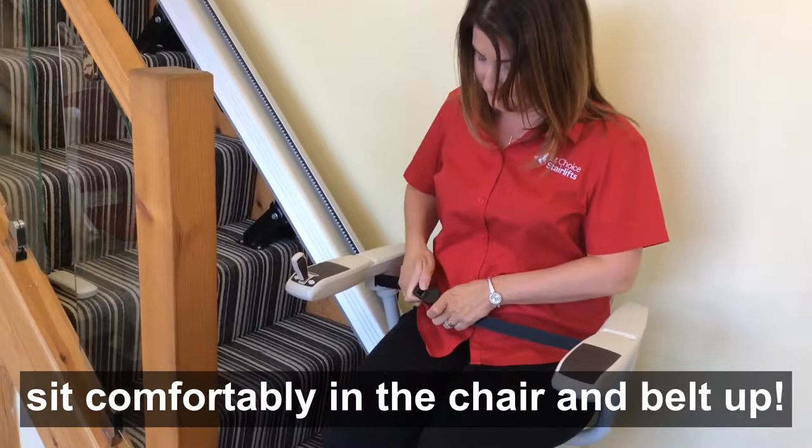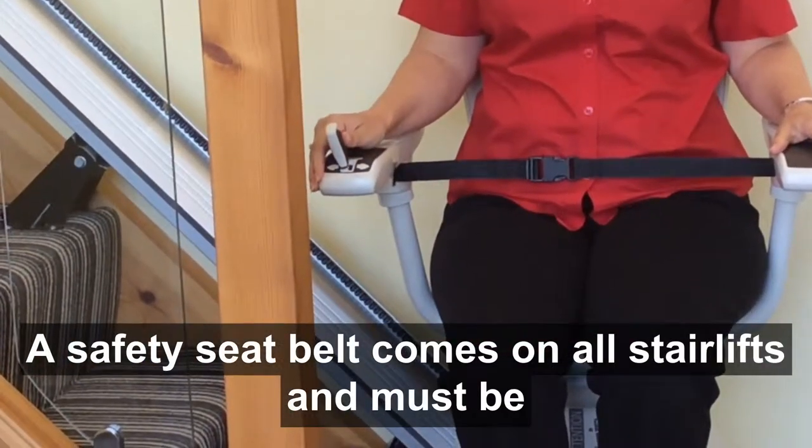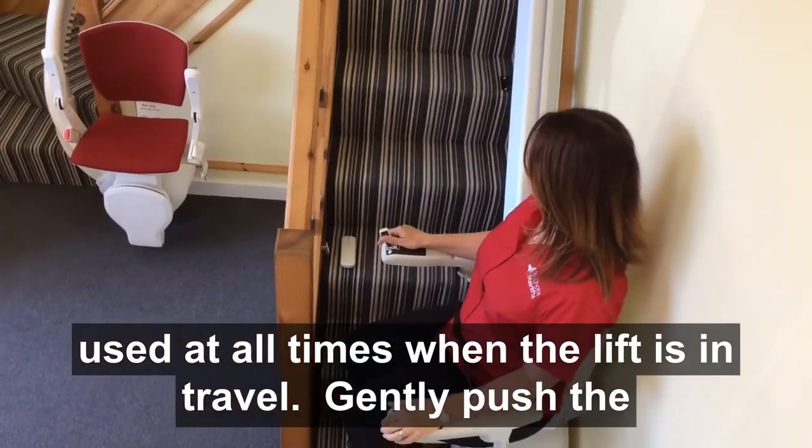Sit comfortably in the chair and belt up. A safety seat belt comes on all stairlifts and must be used at all times when the lift is in travel.